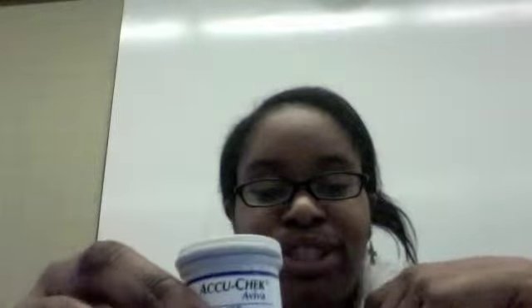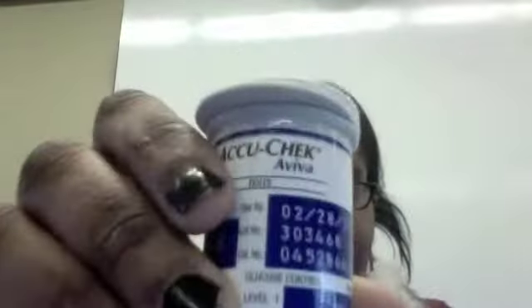I haven't been able to check it because of classes and whatnot. So I'm going to show you what you need to check your blood sugar. These right here, they're your test strips. I don't know if you can see it okay, but these are the test strips that I use. I use AccuCheck Aviva, so this is the example I'm going to use for people who take AccuCheck Aviva. I'm going to get a nice close-up of that as I get ready for my blood sugar test. Depending on your insurance, you can get blood strips that cost no more than 15 bucks. And it's definitely been helpful if you're strained.